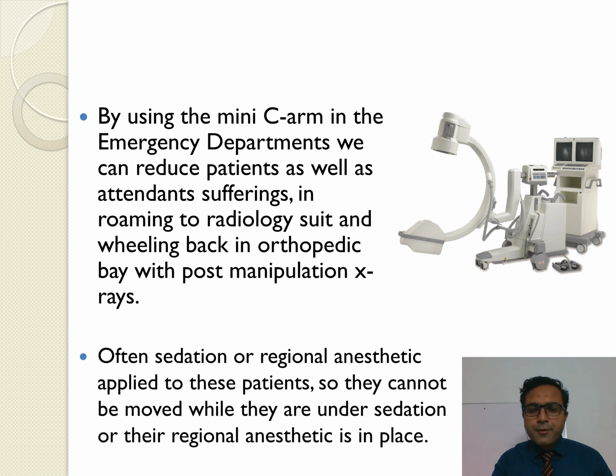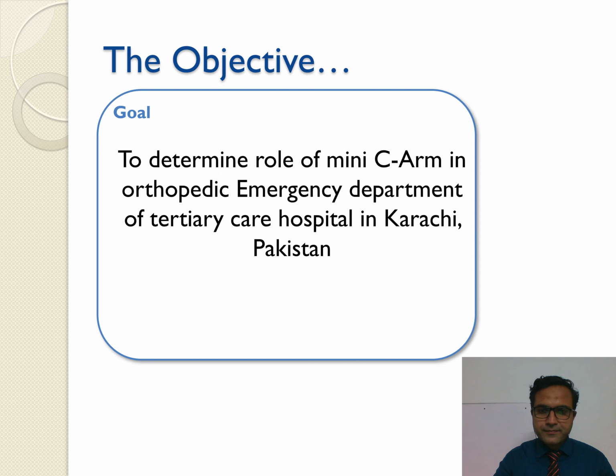By using the mini C-arm in the emergency department, we can reduce patient as well as attendant suffering in roaming to the radiology suite and wheeling back to the orthopedic bay with post-manipulation X-rays. Often sedation or regional anesthesia is applied to these patients, so they cannot be moved while they are under sedation or their regional anesthesia is at work.